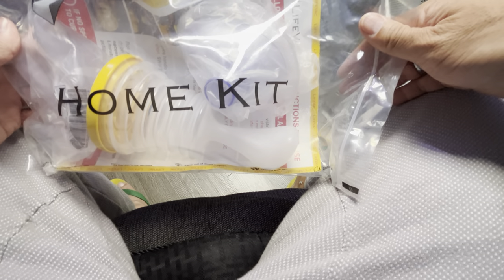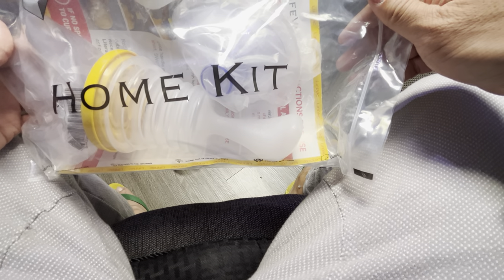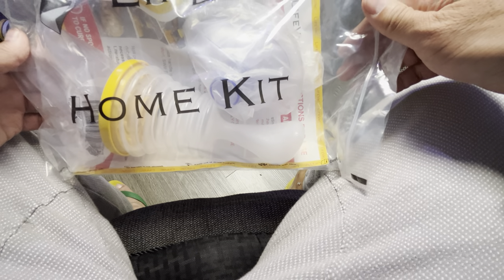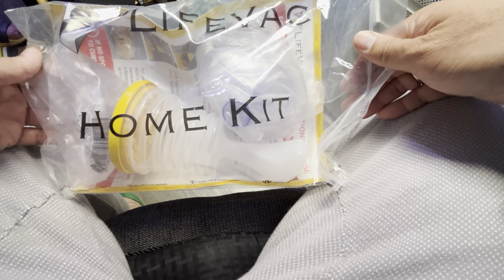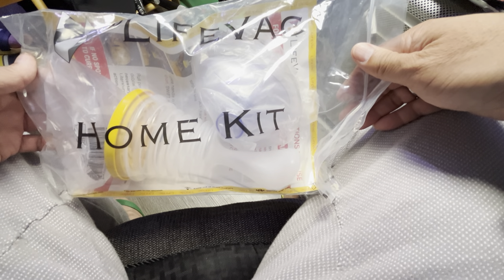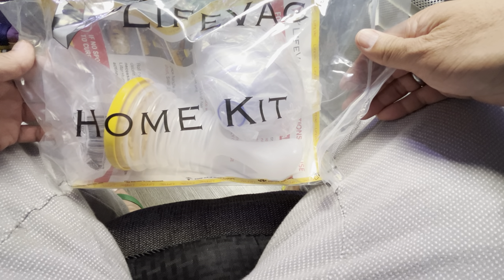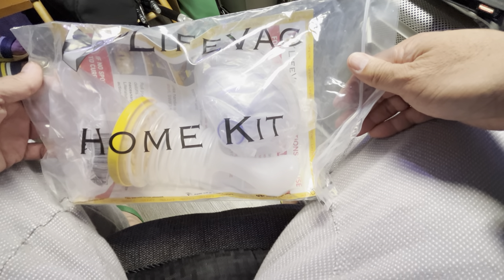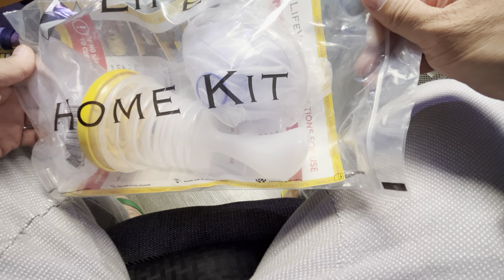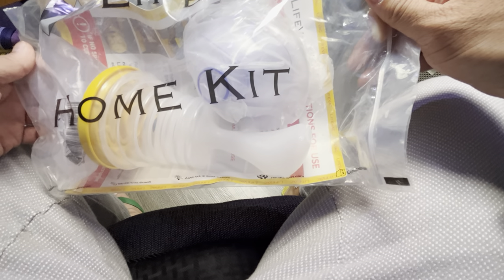They really have saved lives in regards to suctioning any foreign objects in the mouth. I myself am in the medical field and coming across CPR — I've never done Heimlich, thank God. But I can only imagine what a struggling, choking individual or baby might come across, knock on wood.